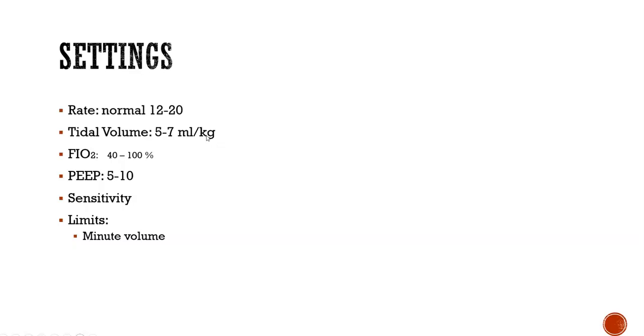So usually anywhere between 350 to 500 is where I have seen tidal volumes. And 500 is going to be like your upper range, like someone is really, really large. A normal tidal volume is usually about 350 to 400-ish or so. But if you start getting tidal volumes too much, you're going to pop lungs as well.